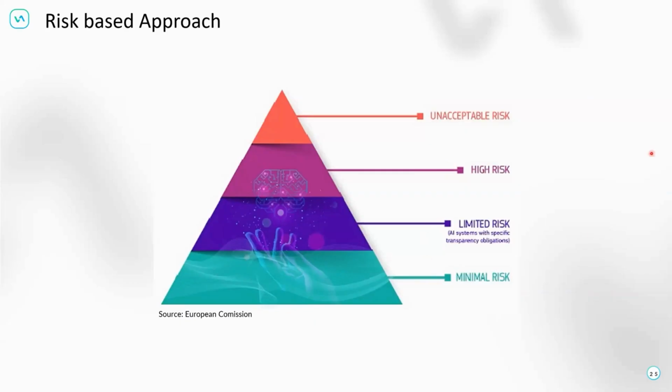Limited risk and minimal risk are particular AI systems which have been proven or which can be shown to have a certain level of transparency, certain knowledge, and are not part of that annex list in the AI Act, and those are then in the particular risk levels of limited and minimal risk and do not fulfill a safety critical functionality. So most medical devices will be in the high risk section. Some of them will be in the limited risk section, but that's very rare. So we have this particular calculation to be covered.